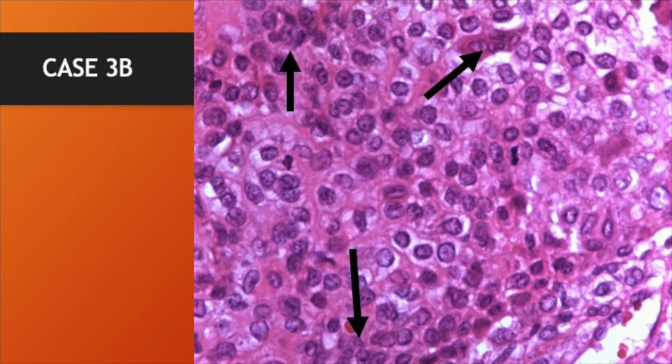borders here, but I've pointed to the background cell population of this particular tumor compared to the area that has that cobblestoning phenomenon. So down at the bottom, upper left and upper right here, there's actually no clear delineation from one cell to the next. There's lots of nuclei with lots of eosinophilic material. That's the actual tumor itself.